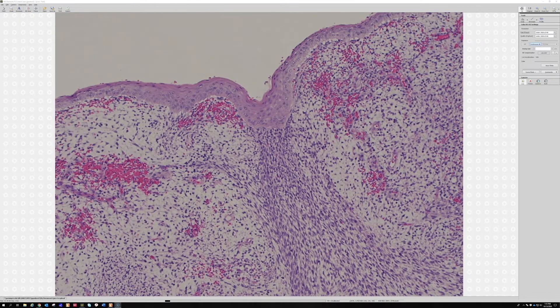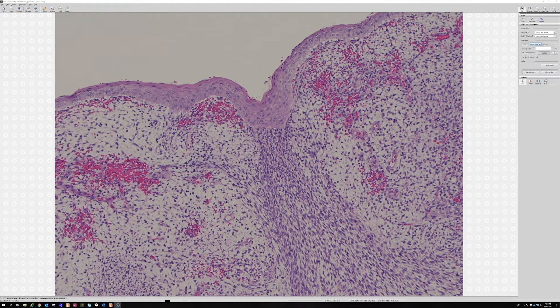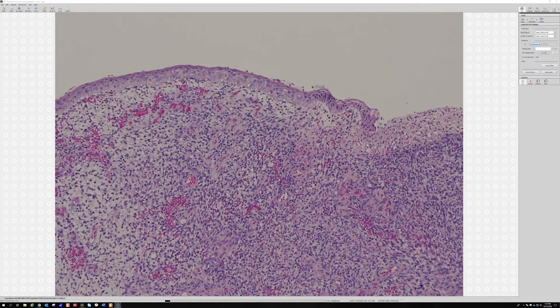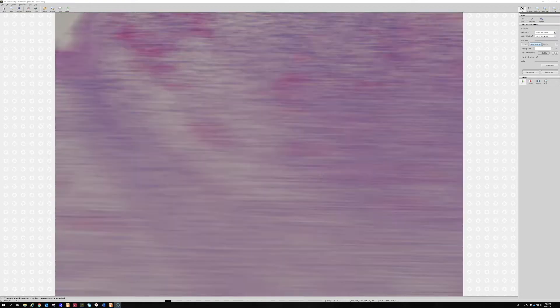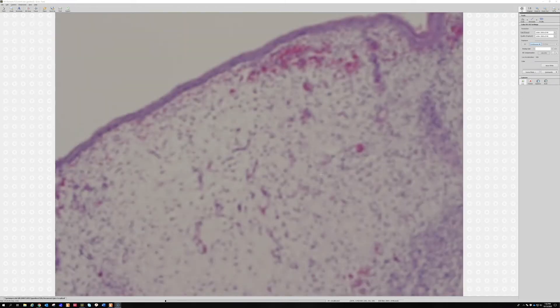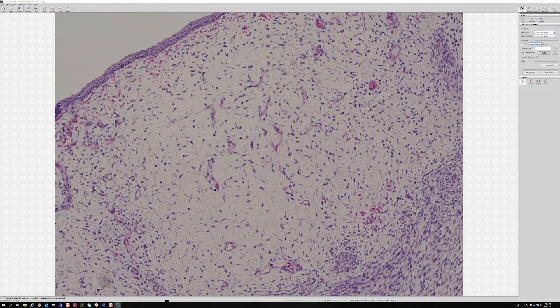That's a very reasonable differential. Fibroepithelial stromal polyps can be seen in genital sites — they can get very cellular and weird looking, so it's always good to think about that benign option for unusual spindle cell tumors in the genital region. But in this young kid with a polypoid mass in a hollow viscus like the vagina or bladder, that's the classic buzzword for botryoid-type embryonal rhabdomyosarcoma. These are usually very loose and hypocellular — you would never look at that at high power and say rhabdomyosarcoma. So the classic history and the low-power pattern really help here.